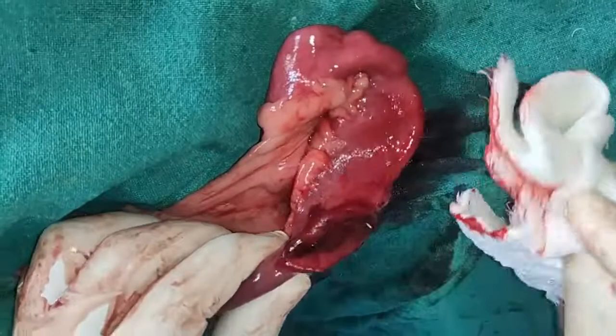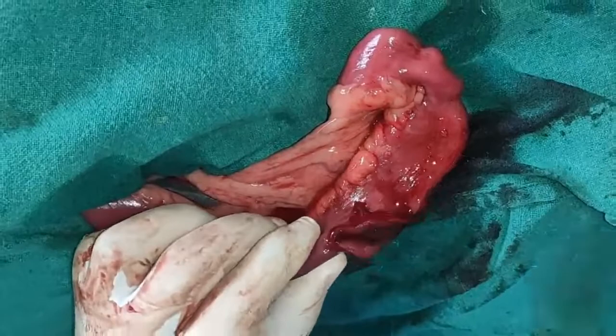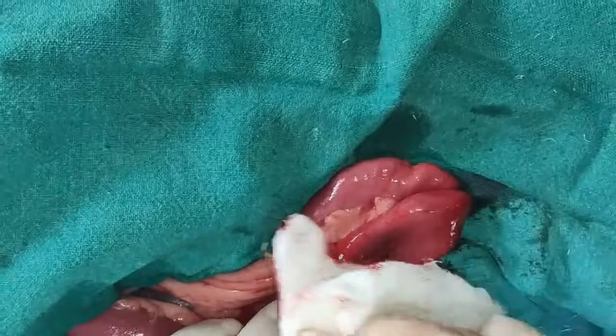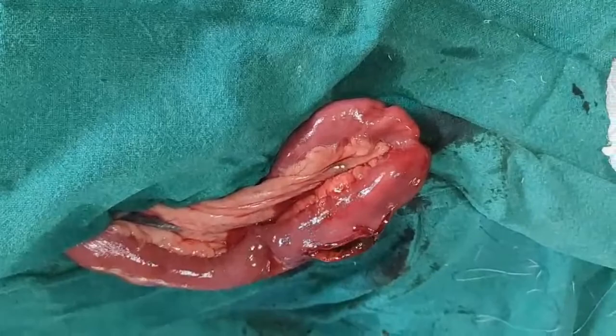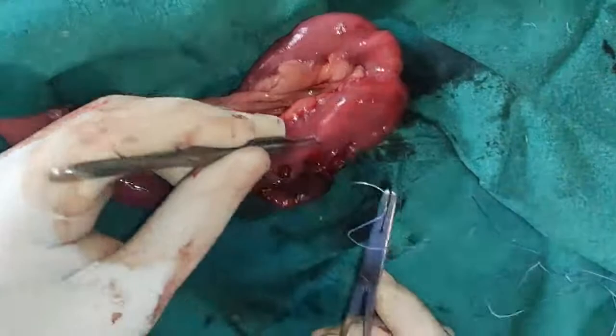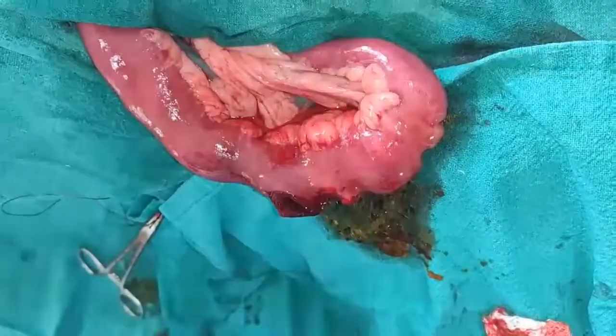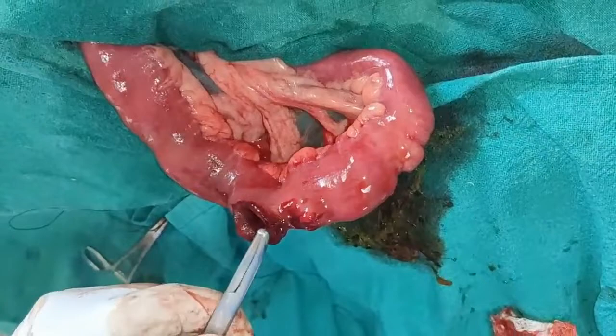Even after giving laxative and other things, there is still a problem. So in such cases we should perform surgery on the same day if we diagnose, particularly if the history is that the duration is 8 to 10 days or 8 to 9 days. So we start suturing. This is the one small tear during the milking. So I am going to cut and change the plan a little bit.